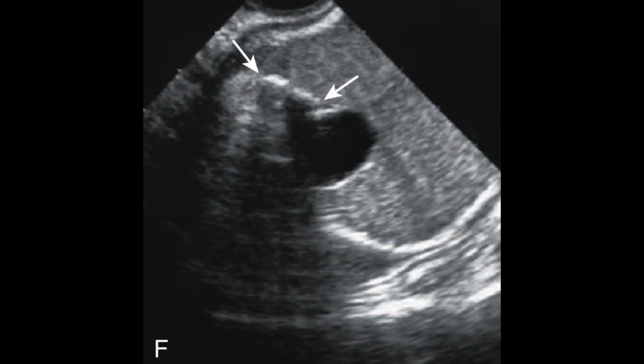You have to be careful, because sometimes you focus only on the calcification or only on the cystic area, since these are quite easy to pick up on ultrasound imaging. You forget the surrounding part, while this cyst as a whole contains these three features, and you have to measure it as a whole; that would be the exact measurement of the dermoid. So this is a dermoid lesion, and it will appear radiologically in this pattern.